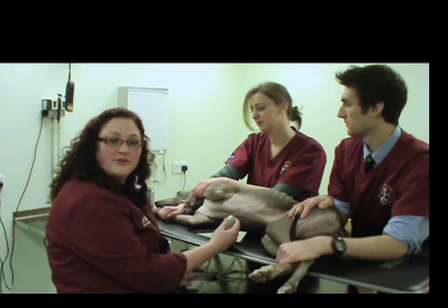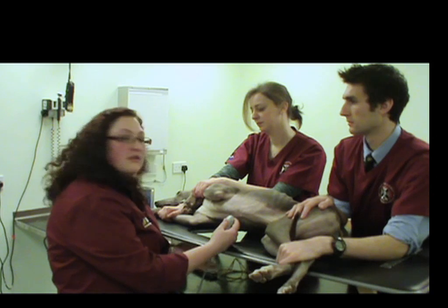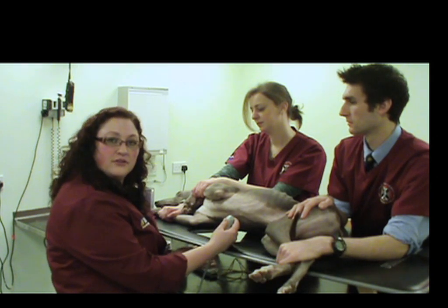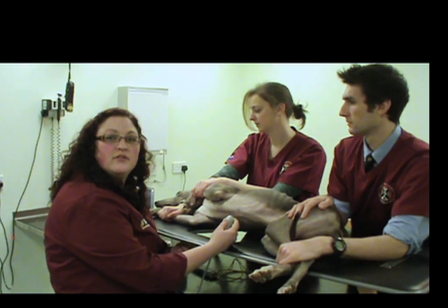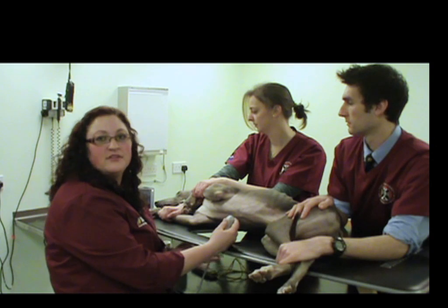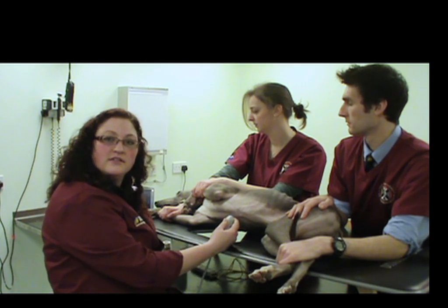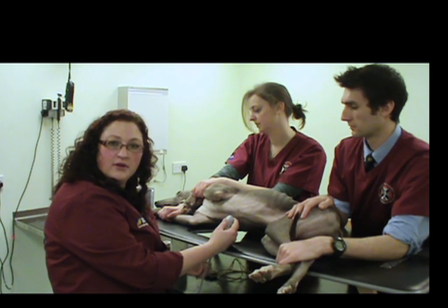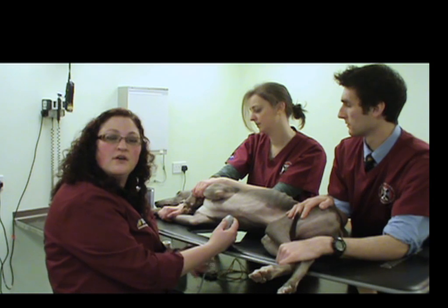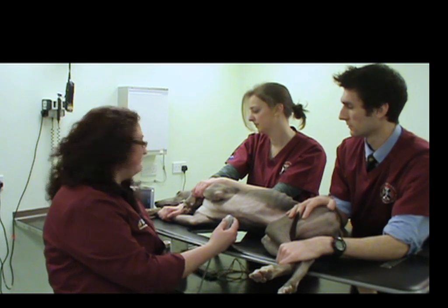We will look at how to obtain the right parasternal short axis views of both the mushroom view, the fish mouth — in other words, the level of the chordae tendineae and the mitral valve leaflets — and also of the aorta and the left atrium.